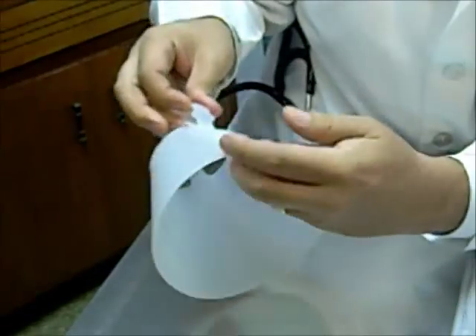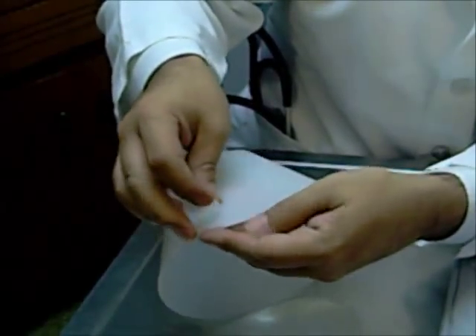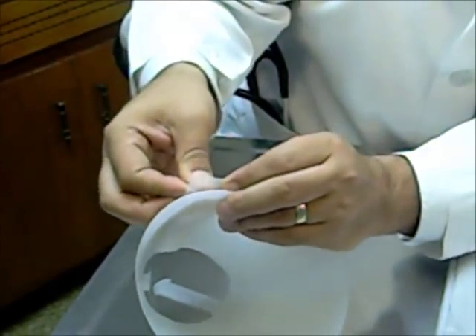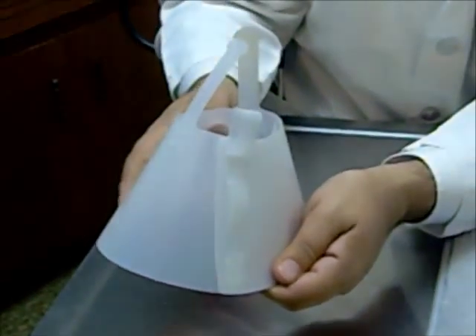So now we've got tab A, and this is slot B, C, D, E. This is slot F — our extra one so that this tab isn't sticking out. We just sneak it in to slot F. Now we've got our nice little collar with the right size.